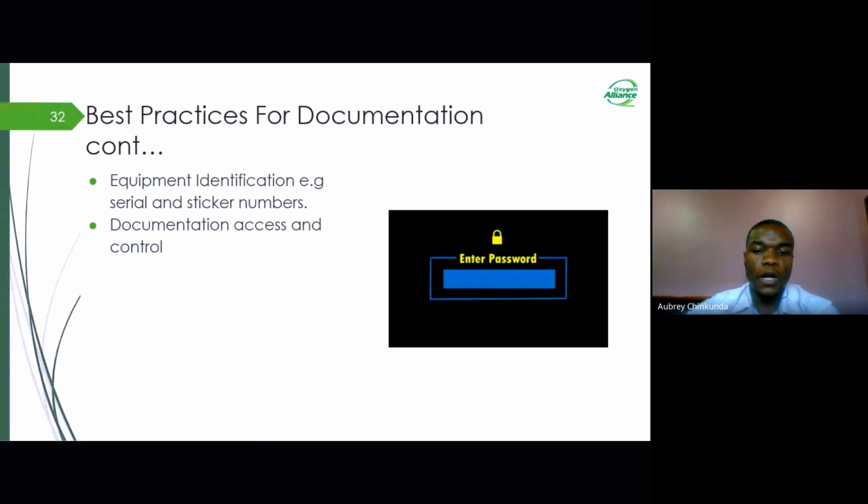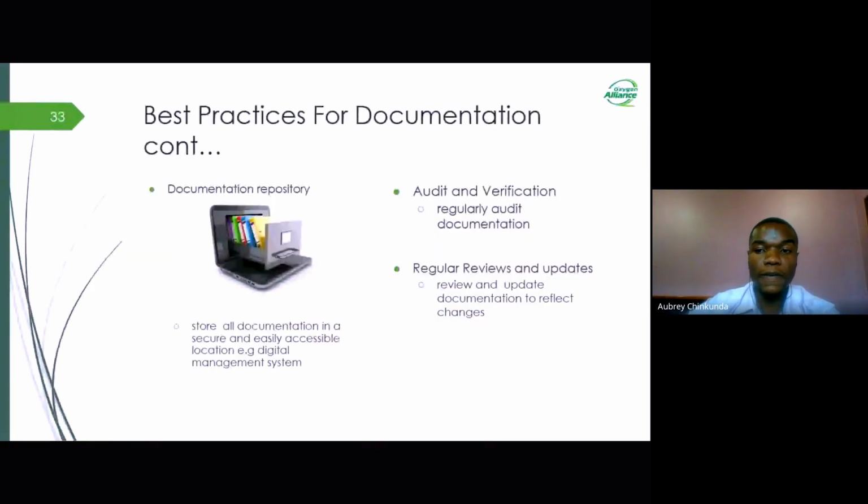Moving on, it is also encouraged to have all the documentation stored in one place that is organized, easy to access, and also secure, such as a digital management system. Make sure that you audit and verify the documentation regularly, and ensure that it is up to date and reflecting the situation on the ground.